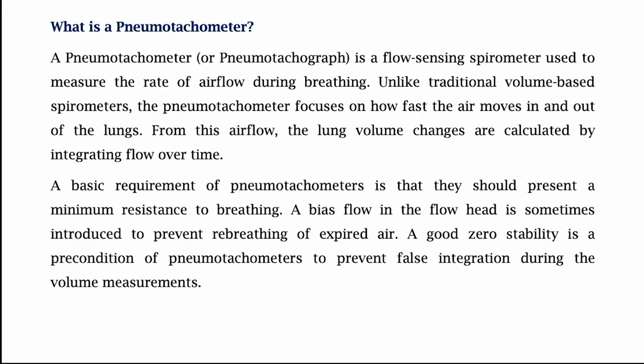So what is a pneumotachometer? Essentially, this is a spirometer, a measurement device that is used to measure breath as a flow. Previously, when we looked at flow measurement systems, we were talking about blood flow.